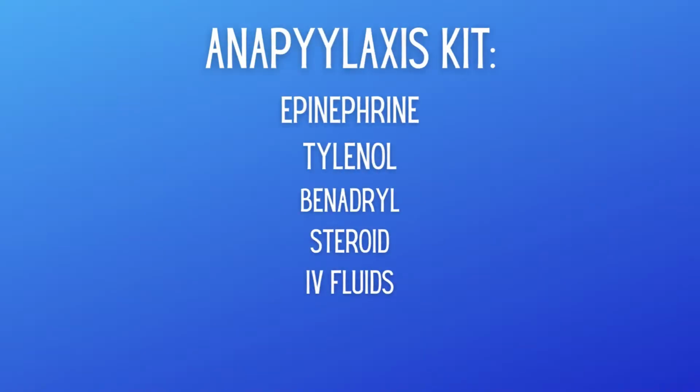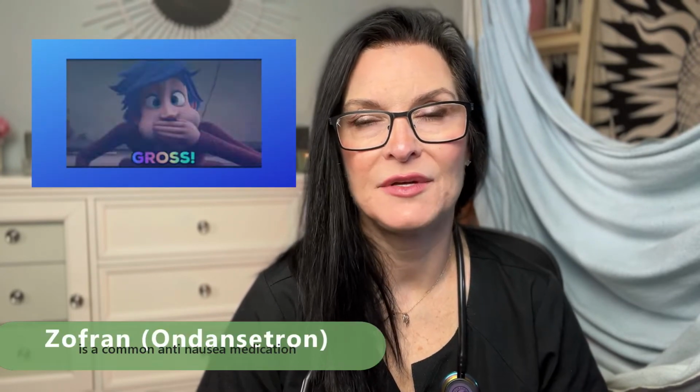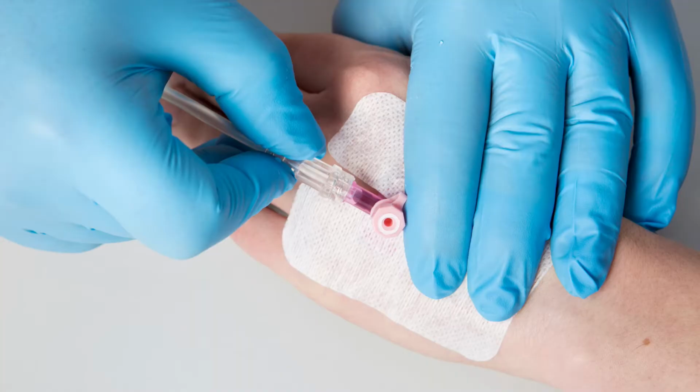And she's going to double check to make sure one in particular is there. And that is called the Anaphylaxis kit, or the Ana kit for short. And this is a kit that contains epinephrine, a dose of steroids, extra bag of IV fluids, and maybe some anti-nausea or antiemetic medication. Just a fancy way of saying anti-puke medication, basically. She'll make sure all of that's there, and she should not start your infusion if it's not, just FYI. She'll take your vital signs, and that is your heart rate, temperature, blood pressure, and respirations. And then she will start an IV on you.